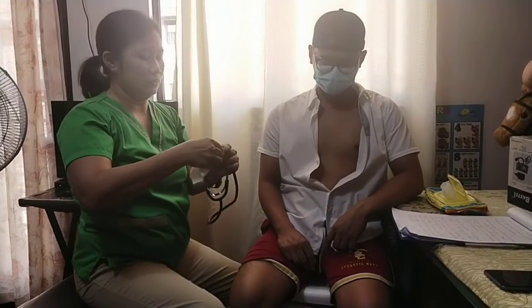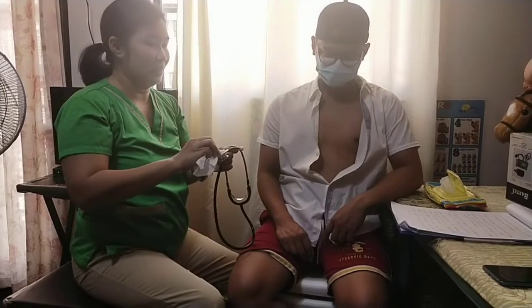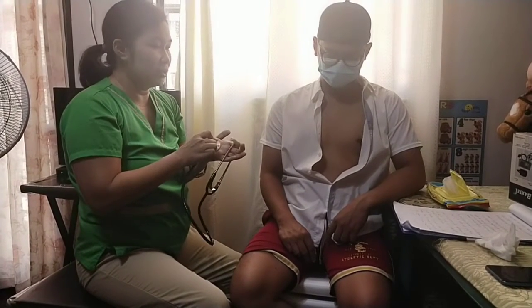Then we have to auscultate and count the heartbeats. Before we start counting the heartbeat, let us use the antiseptic wipes to clean the earpieces of the stethoscope and the diaphragm, and warm the diaphragm of the stethoscope by holding it in the palm of our hand for a moment.